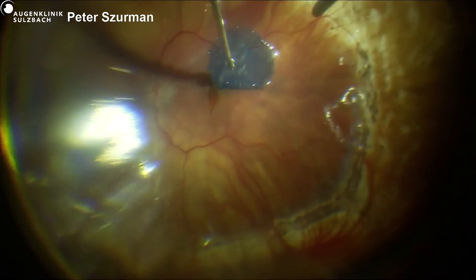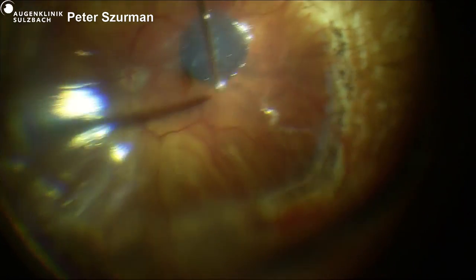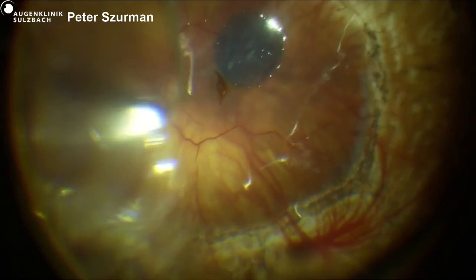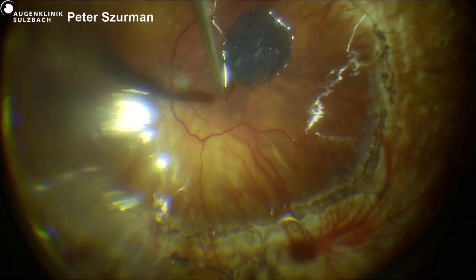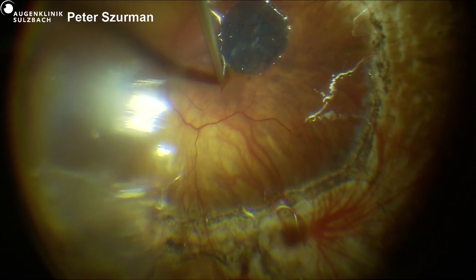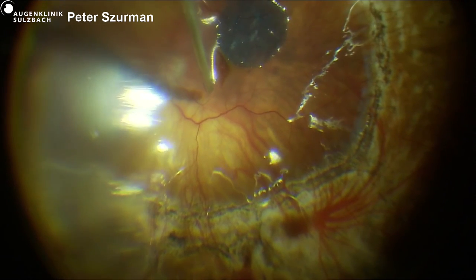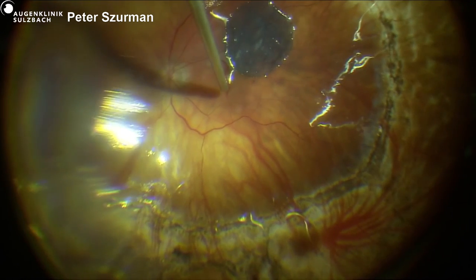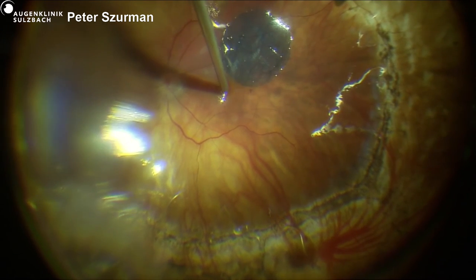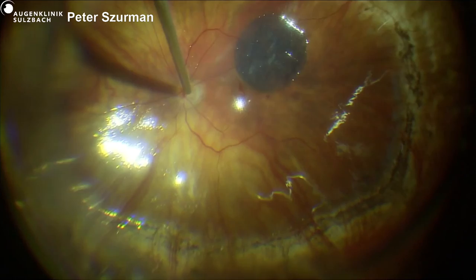What I found was that there's still an attached hyaloid. I don't know whether you can see the hyaloid, which is attached to the cortex from the periphery. So this is the good news, because at least we spared one surgical step. I don't think I'm going to peel the membrane because there is no obvious traction. The macula is fine and flat. So I will continue dissecting the hyaloid from the periphery, looking for the retinal break, the recurrent retinal break, possibly the recurrent defect.